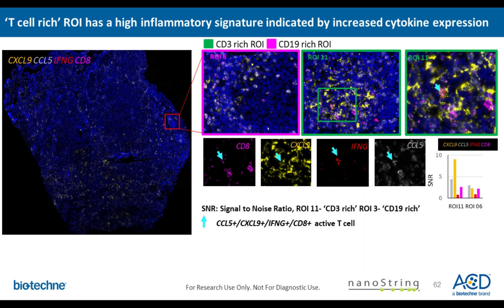One of the most important things to take from this slide is the correlation between the DSP data shown in the graph in the bottom panel and the RNAscope staining for these 4 targets. This really tells you that both these techniques have concordance and can synergistically be used in a workflow to spatially map gene expression.